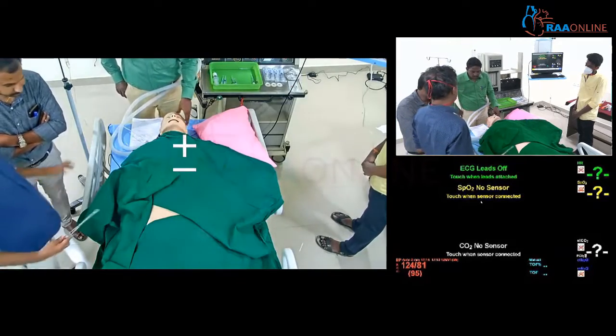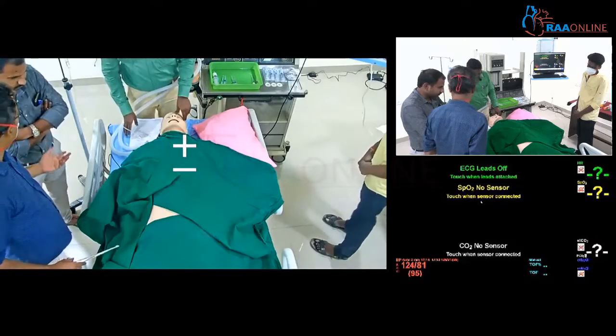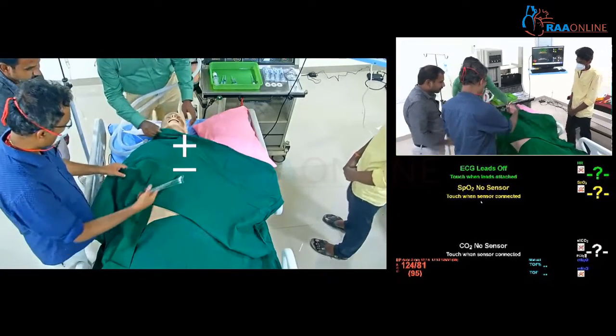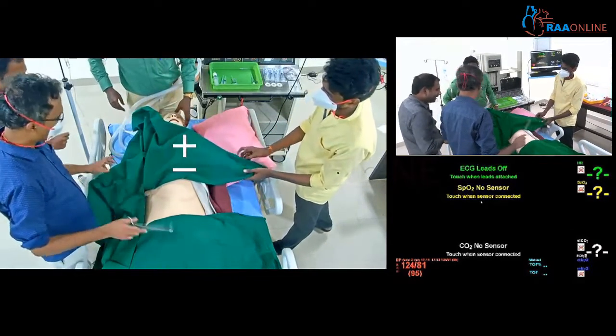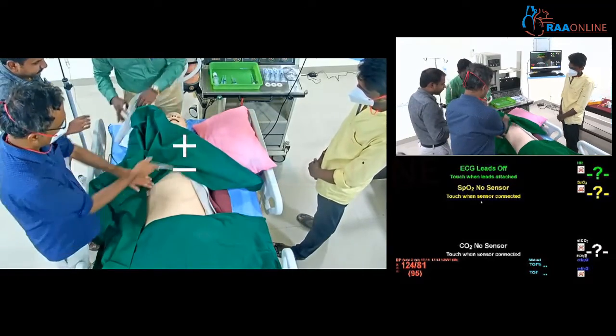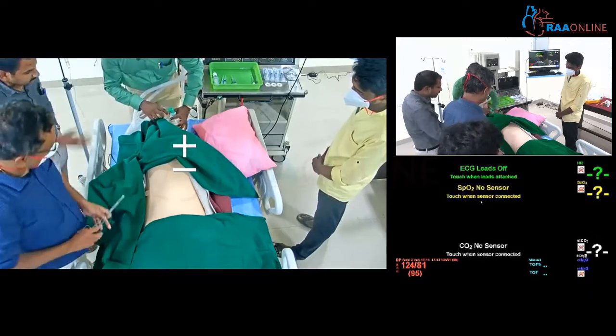Now, sir, do you have any concerns to say to us? I want things to be done fast. I have another case to go to. Haven't you intubated the patient yet? I will do this. Remove the drapes, I have to put that. Sir, we haven't induced yet. Just give me 5 minutes. No, I will do it. I don't have time. I'm just going to clean and drape. Please go and intubate. Please pull out the drape. I'll pre-oxygenate, sir. Just keep the mask. Have you taken the consent, sir?